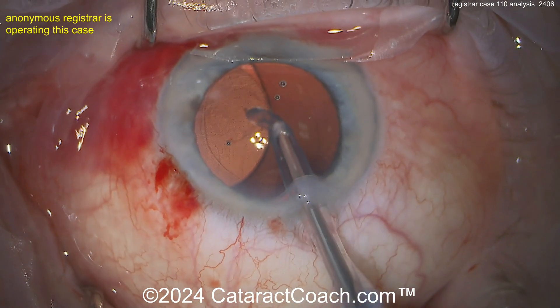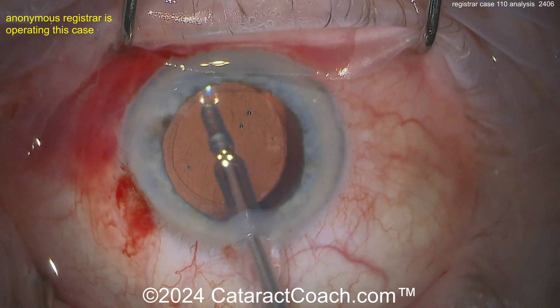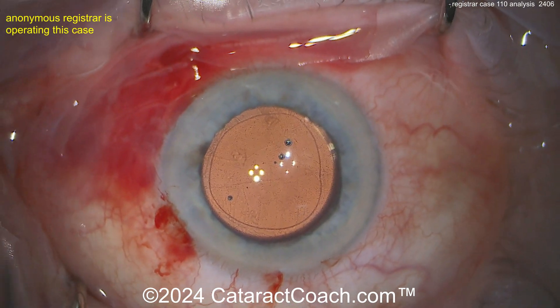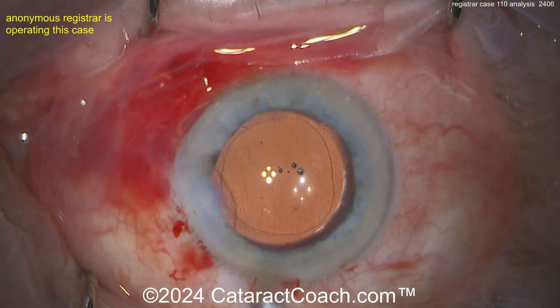You were doing great — fantastic job. Just keep in mind: figure out your fluidic settings. You shouldn't have that chamber bounce, that AC instability — the bounce bounce bounce. Don't want that. Beautiful — look at that, that's a fantastic-looking rhexis. Let's seal up the incisions here, nice and easy.